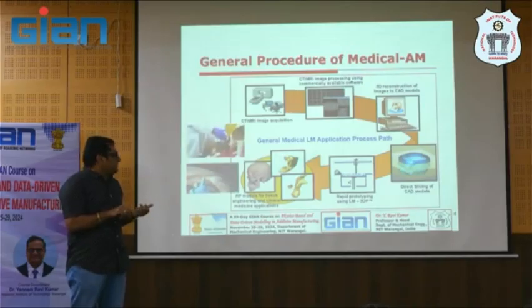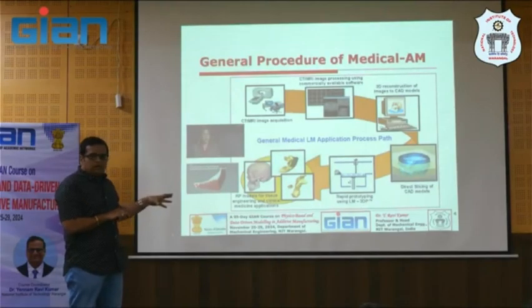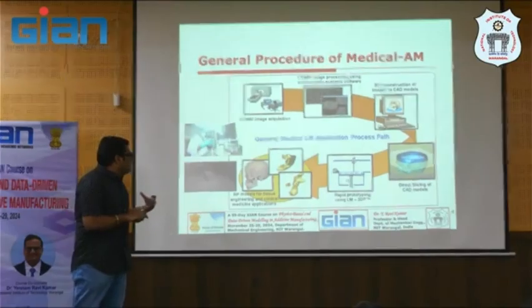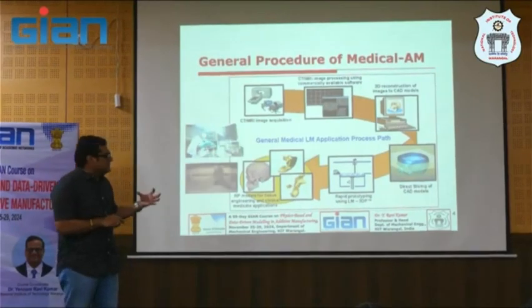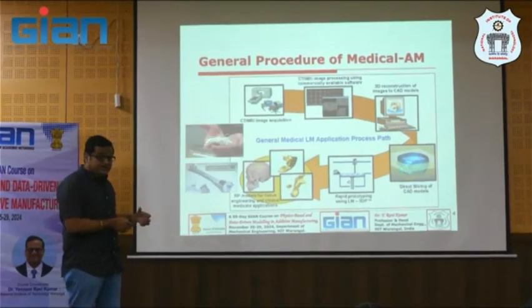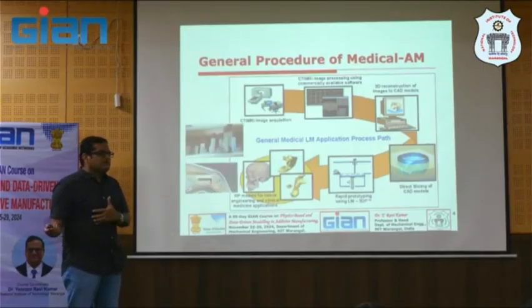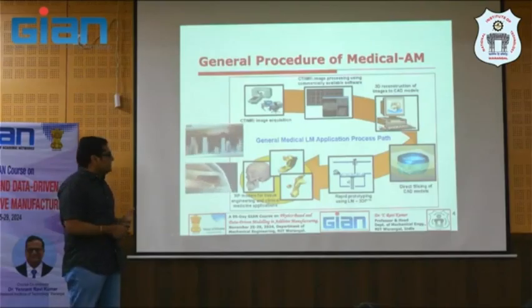Once you make it layer by layer, how do you see that model? How do you see that printed anatomy that has been captured from the patient, right? You can use it in several applications. We'll try to see some of them from the literature as well as from our experience with the surgeons that I'm going to share with you.